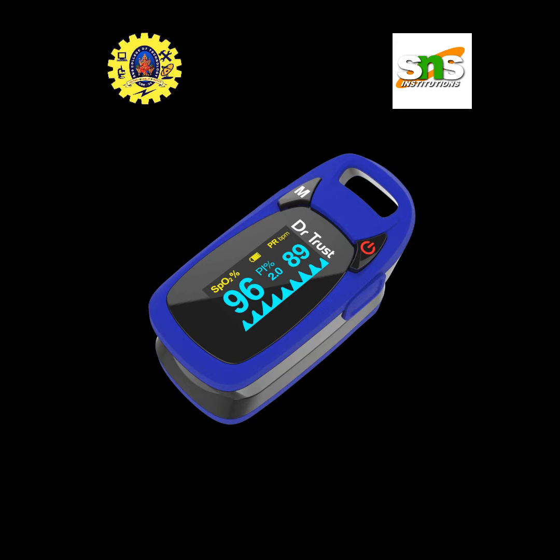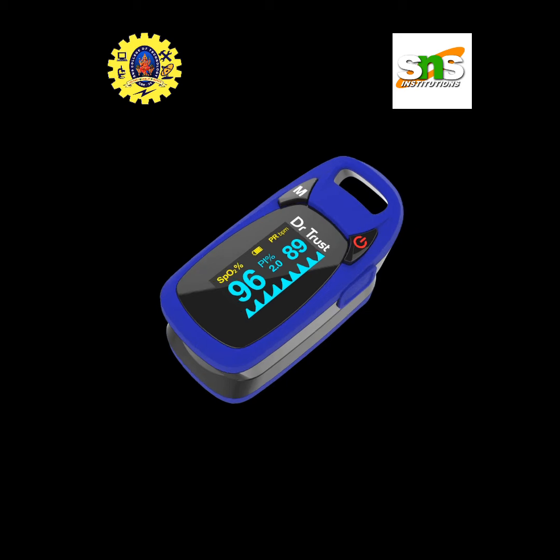Oxygen saturation: blood carries oxygen, which is necessary for our life. Oxygen in blood is specifically carried by the hemoglobin molecule. Here are two hemoglobin molecules. One is with oxygen and the other is without oxygen. Hemoglobin without oxygen is called deoxygenated hemoglobin and hemoglobin with oxygen is called oxygenated hemoglobin. Oxygen saturation simply refers to the percentage of available hemoglobin that carries oxygen.